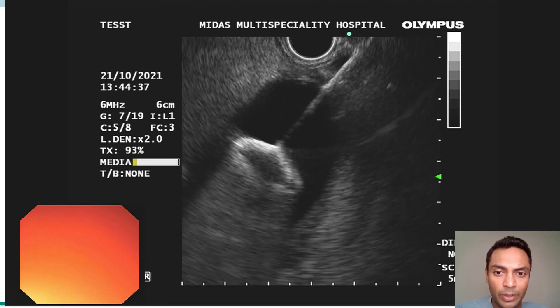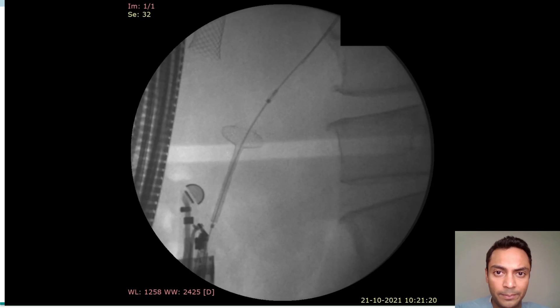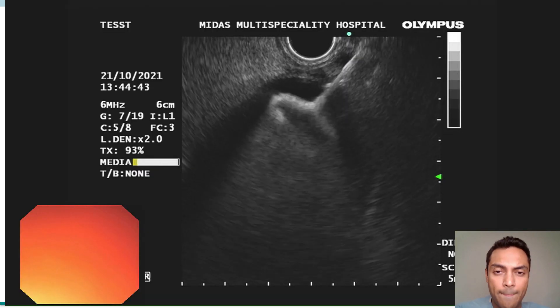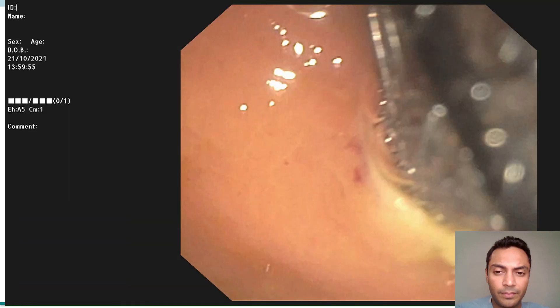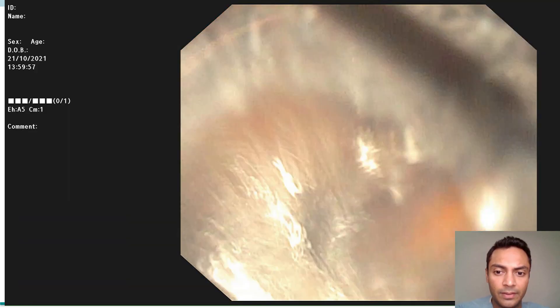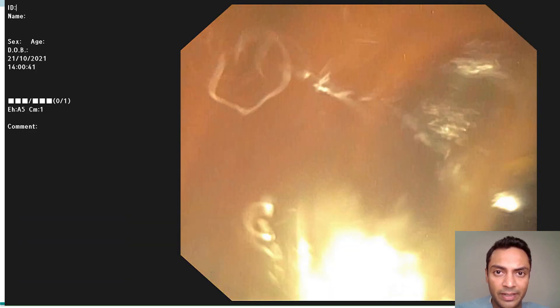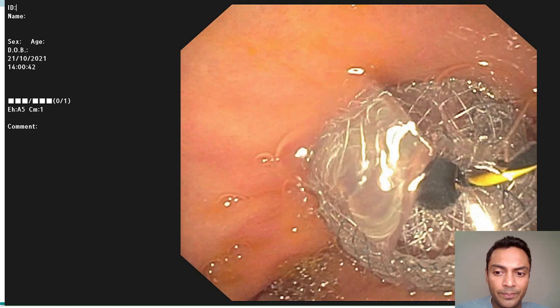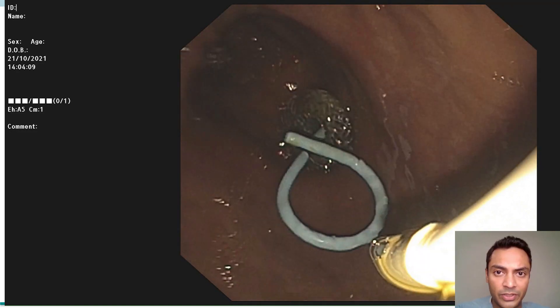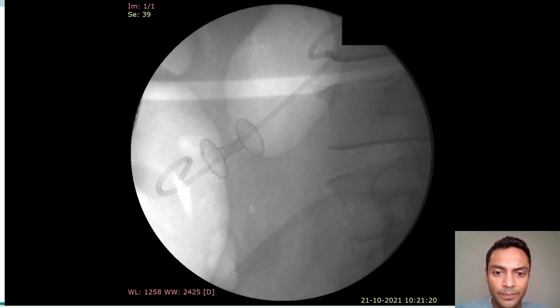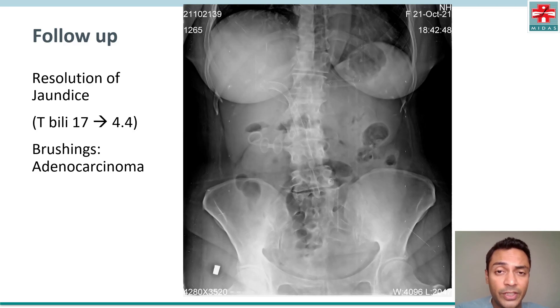The inner flange is deployed in the gallbladder. Next, the flange on the stomach side is deployed, and there was clear bile and pus seen coming out. On follow-up, she did fine. Her fever resolved, her pain improved, and her jaundice improved from 17 to 4.4.